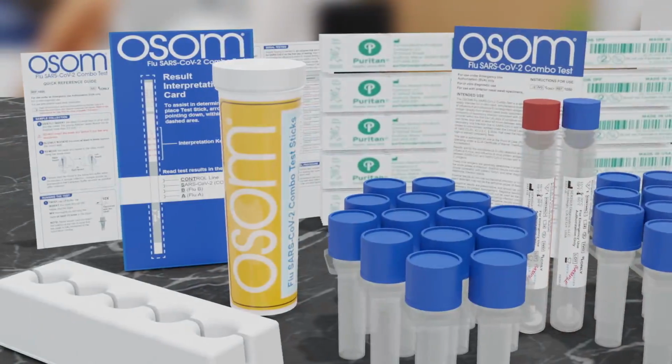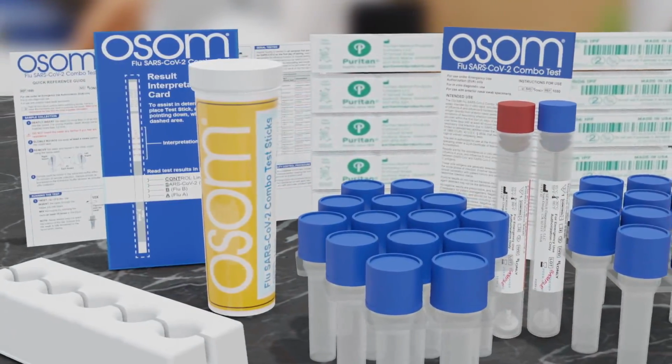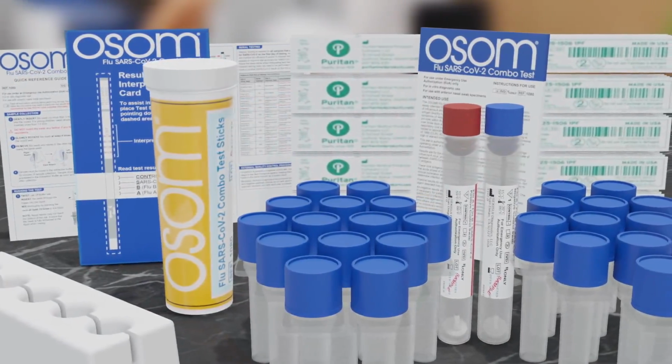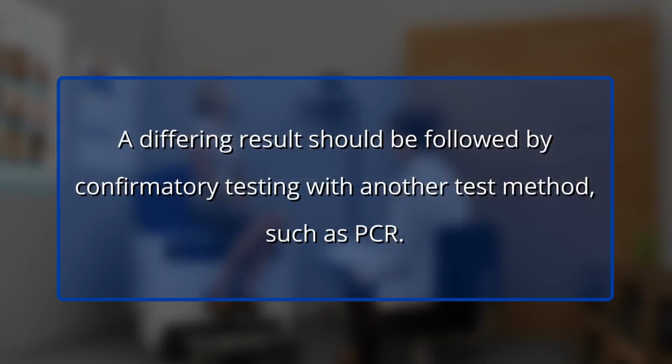It is possible to have more than one positive test line, which could indicate a co-infection with influenza A, B, and/or SARS-CoV-2, the virus that causes COVID-19. If more than one positive test line is observed, retest with a new patient sample, extraction buffer vial, and test stick. A differing result should be followed by confirmatory testing with another test method, such as PCR.